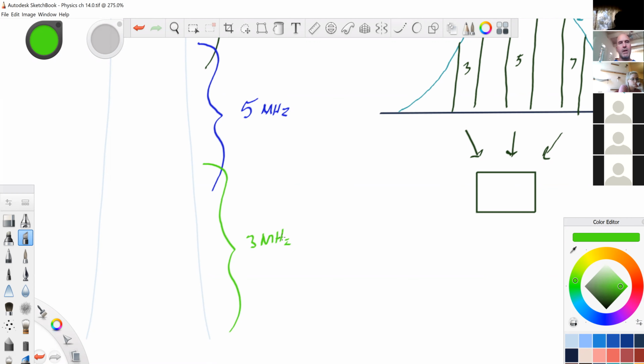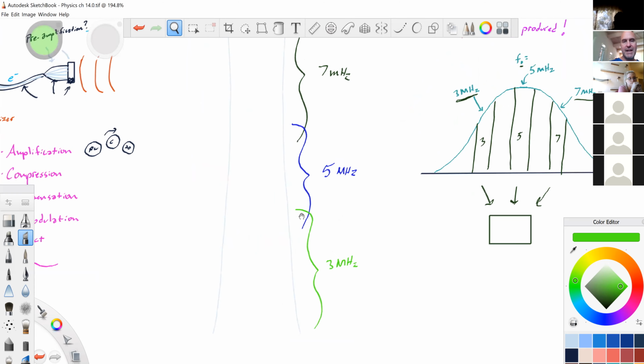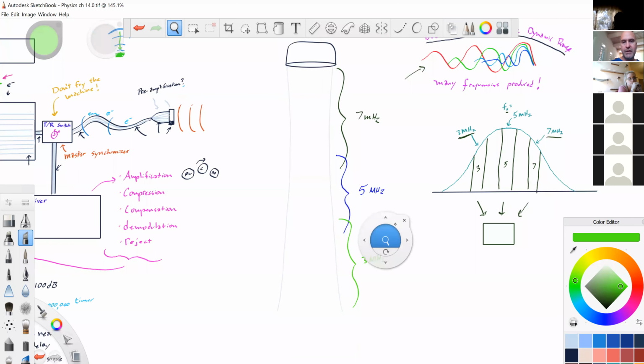You're putting in, no, it's one pulse. But remember, depth and time are the same thing. If this is 26 microseconds, let's say right at that depth, and let's just double that.